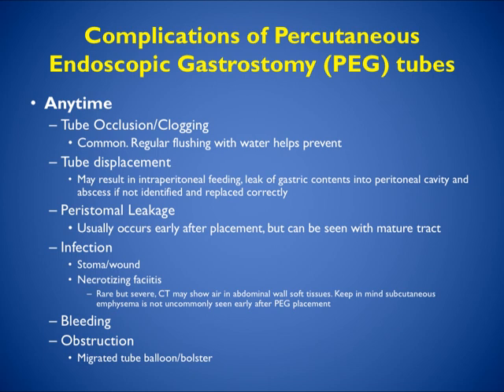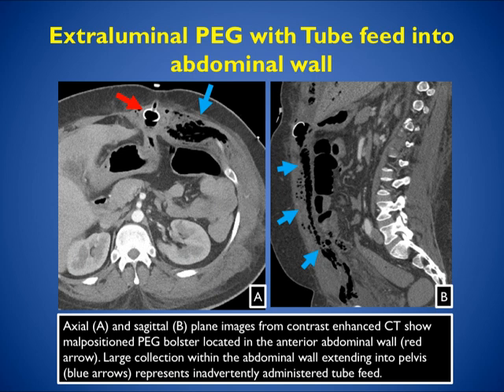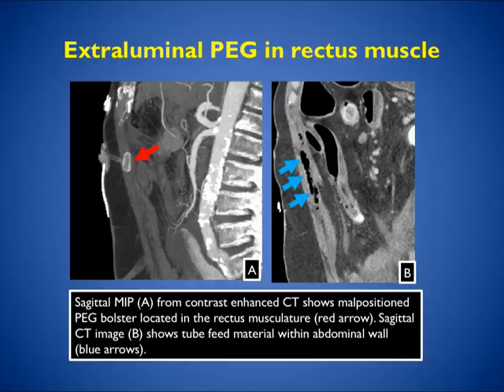Other complications that can occur early or late include occlusion — not uncommon; regular flushing helps prevent this — tube displacement, peristomal leakage, stoma or wound infection, rarely necrotizing fasciitis, bleeding, or migration of the tube balloon or bolster. Here's an example where a large collection within the abdominal wall tracks all the way down into the pelvis. The tube feed is tracking within muscle and the abdominal wall. In another case, there's an extraluminal PEG within the rectus muscle with air visible in the muscle — when we see air in muscle we think infection or necrotizing fasciitis, but it may simply be that the tube is in the wrong place and air enters the muscle when the tube is flushed.